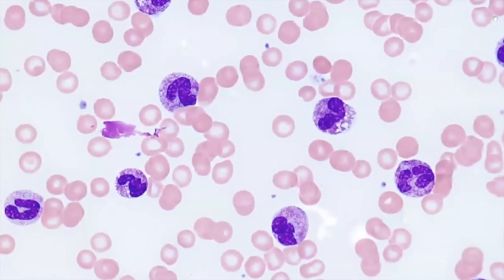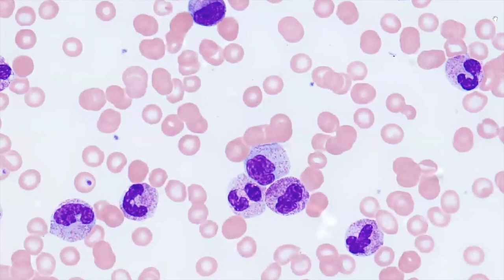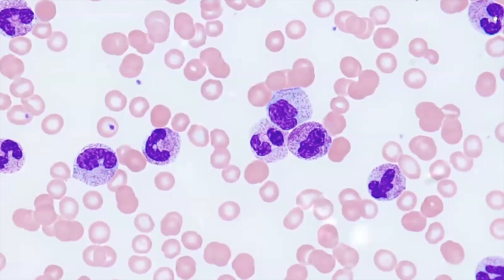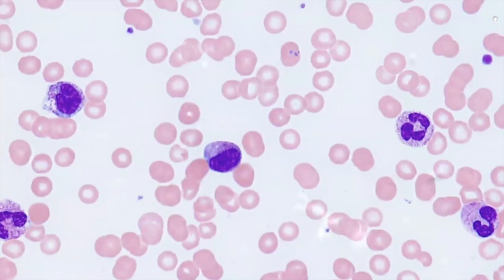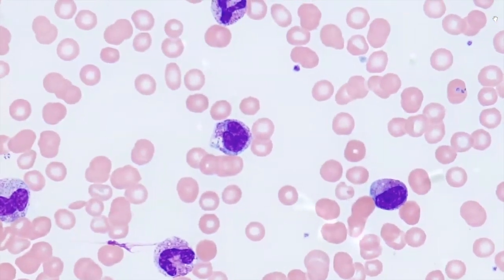pretty much every other neutrophil in this peripheral blood smear, has this coarse granulation characterized by these more basophilic appearing granules that are a bit larger in size. We also notice that there is a left shift in the neutrophil population. Here we see a myelocyte with its round nucleus and maybe a metamyelocyte.